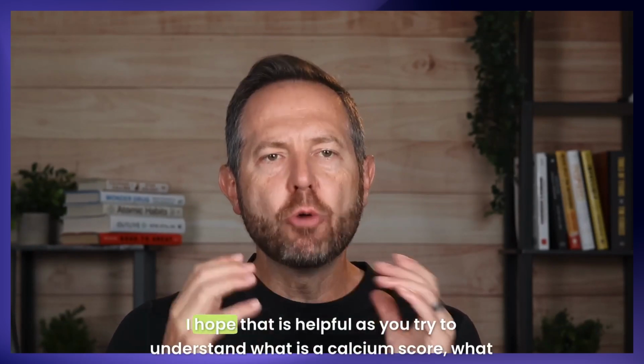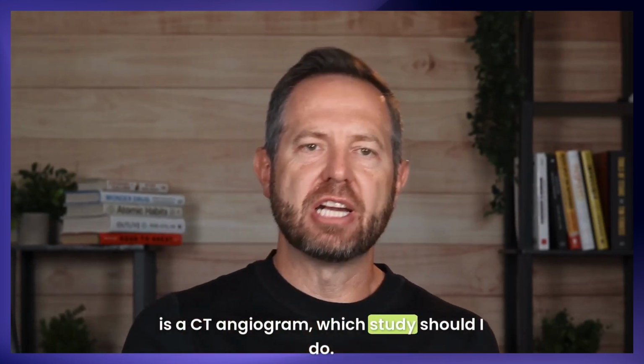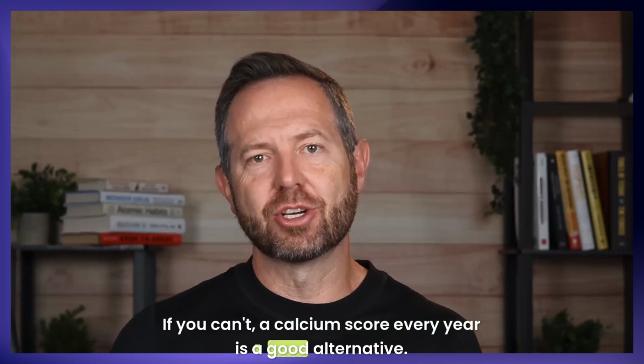So I hope that is helpful as you try to understand what is a calcium score, what is a CT angiogram, which study should I do. If you can afford it, go to the CT angiogram. If you can't, a calcium score every year is a good alternative.